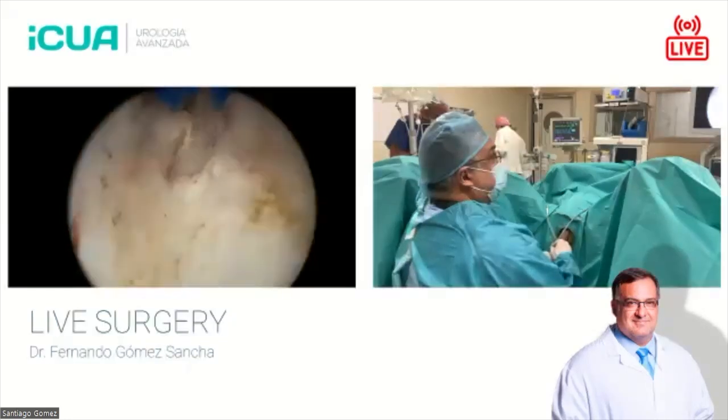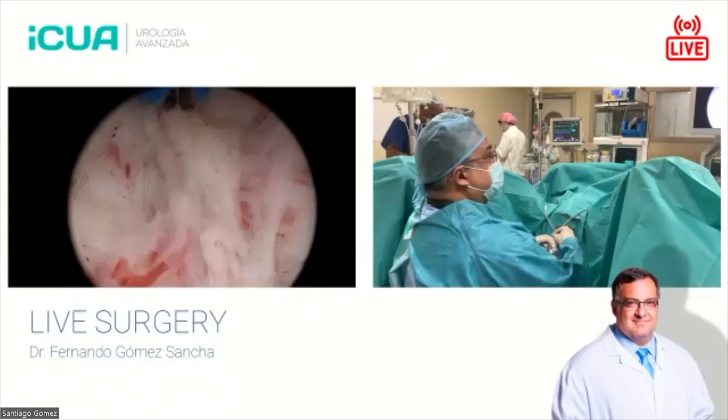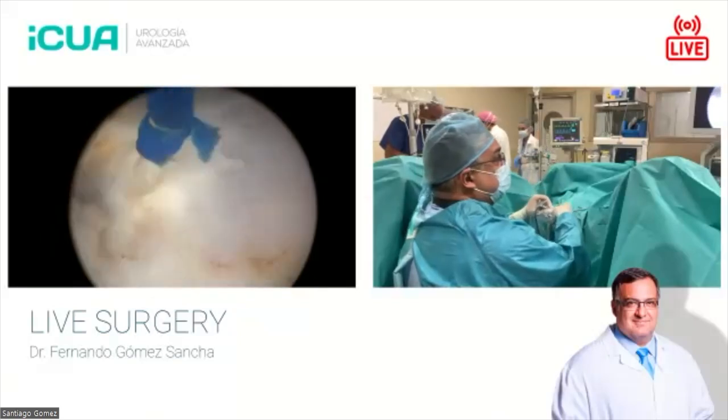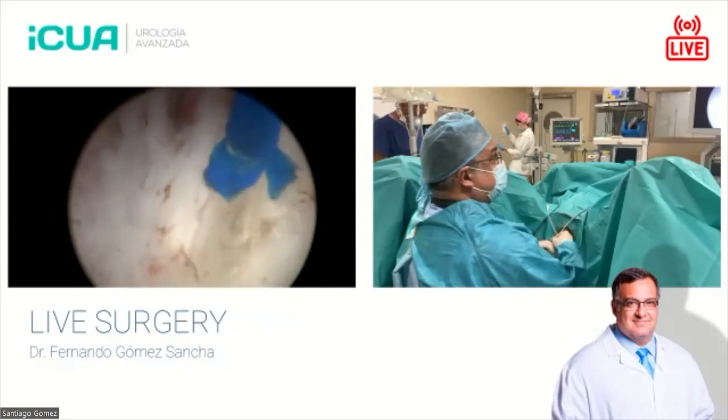So here, what I'm doing now, you see that I entered the bladder here. I'm coming down, I'm connecting the lines, always trying to follow my lines.